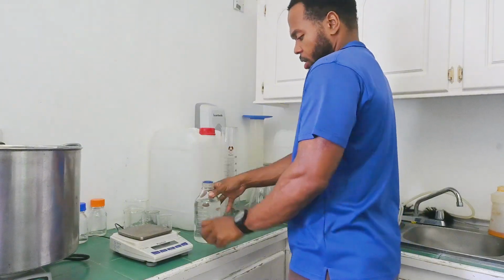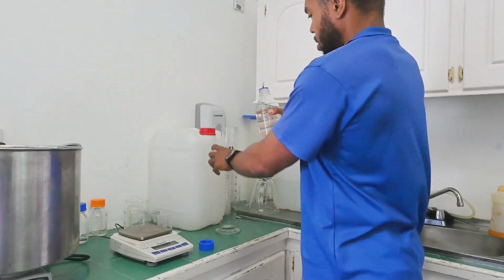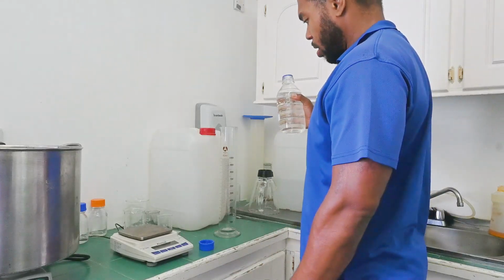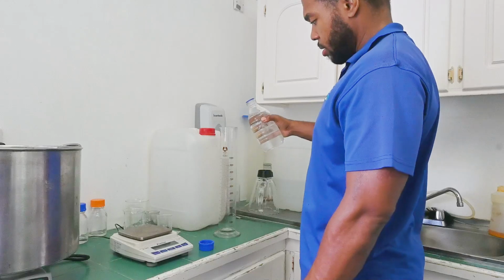The last stock solution is the BA we just prepared earlier. For this one, it's a total of 800 milliliters.